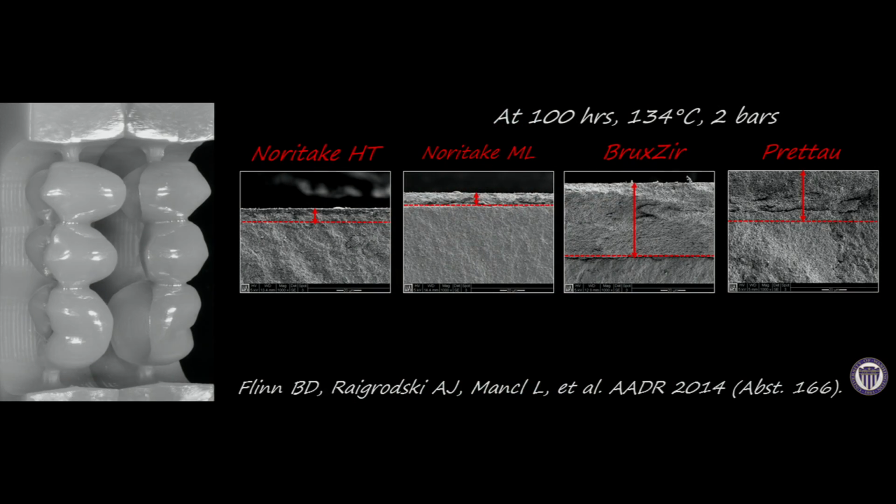And such a minor change, we call it transformation from tetragonal to monoclinic. A small change such as that actually strengthens the material. Whereas with the other 2 materials, we saw significant transformation, significant change in particles, which caused that dramatic reduction in strength. So this is quite encouraging. And if we look at those issues, certainly we know that not all zirconias are the same, and some of them will respond differently in terms of strength.